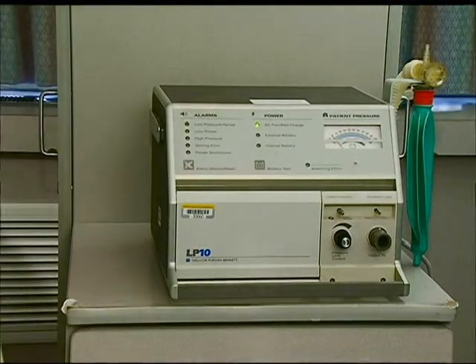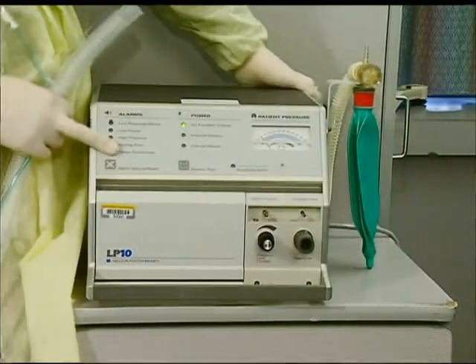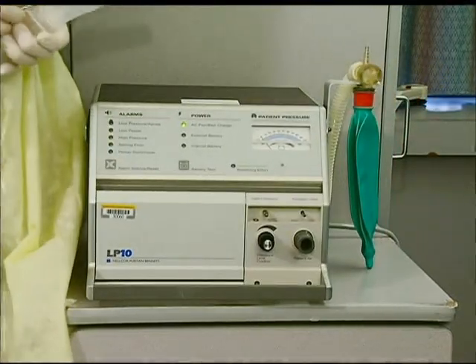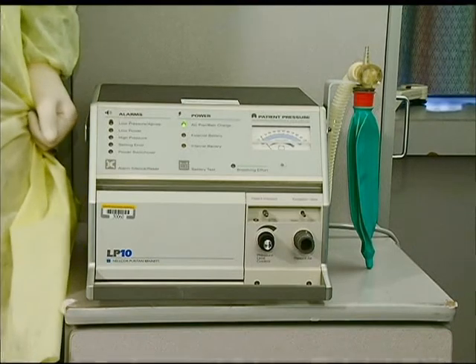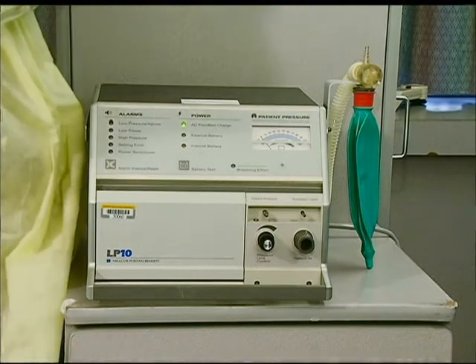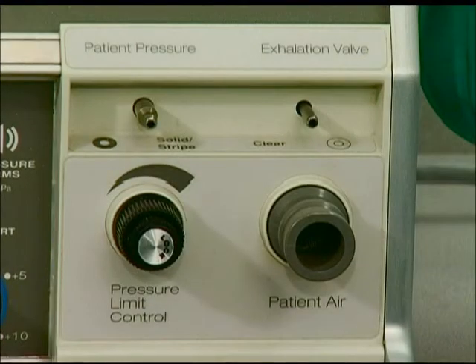The connections that supply the interface between the patient and the ventilator consist of three hoses along with several other pre-assembled pieces termed the ventilator circuit. The connections for the ventilator circuit are located on the lower right front of the panel. The ventilator circuit connections consist of the following: the ventilator gas source to patient labeled patient air, the pressure monitor connection labeled patient pressure, and the exhalation valve connection labeled exhalation valve.